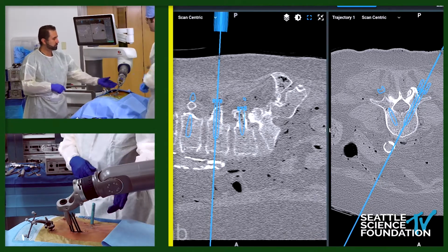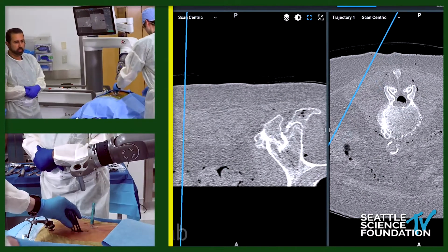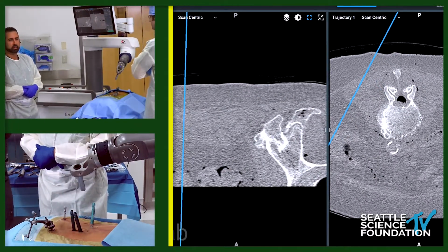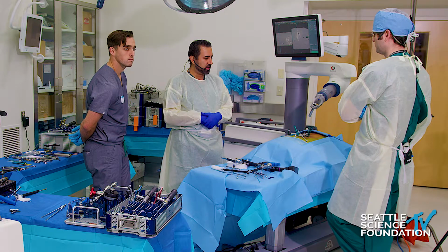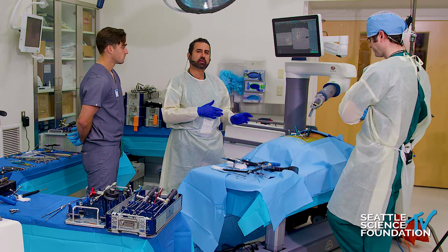And I'm just wondering if that high-speed drill that you're mentioning, is that really good enough to always make sure that you're really getting into that trajectory? I completely agree with your point. I slightly disagree with your solution. I think that tactile feedback is so important, as you know here. But I'm still getting tactile feedback.